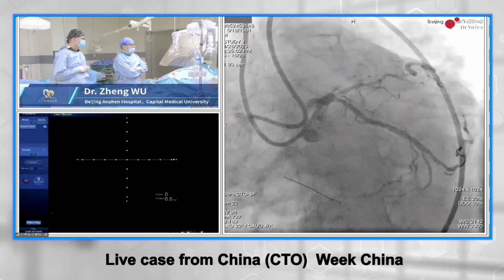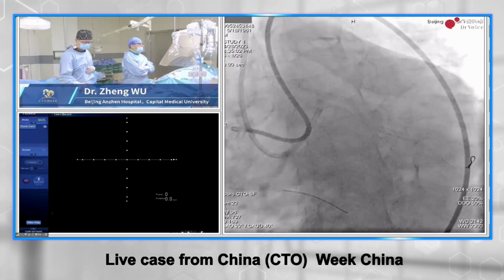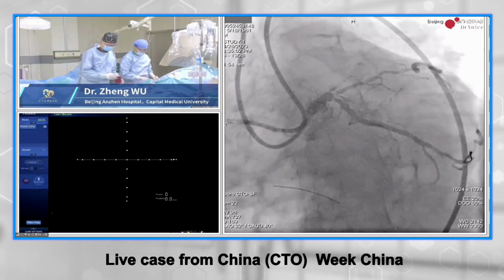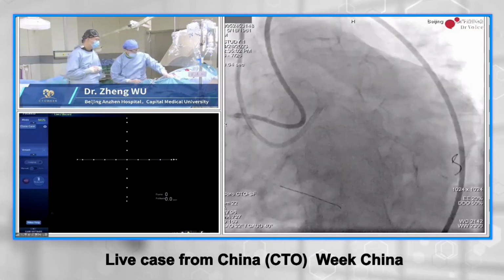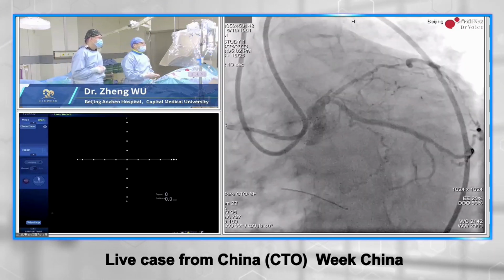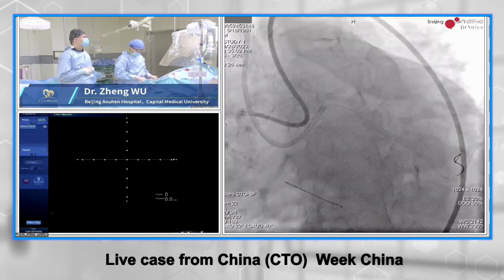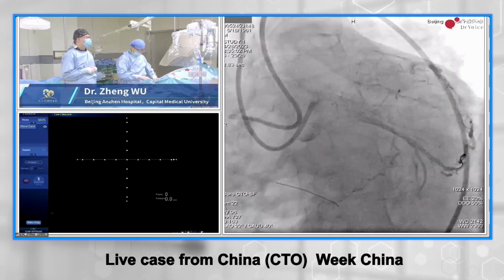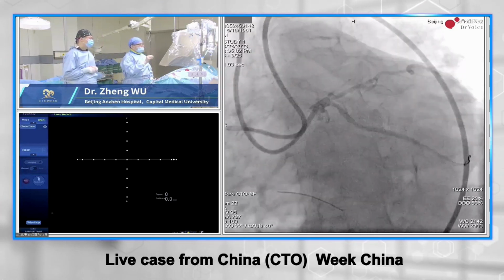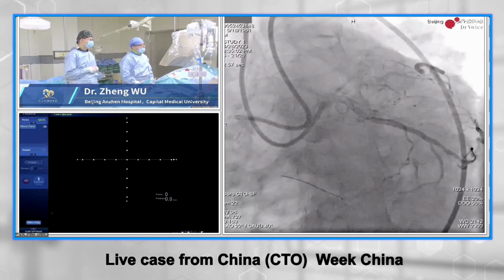Yes. Anyway, Professor Wang. My opinion, you should try the antegrade approach first. And we believe that your feeling will tell you which route is correct. Sure, of course. So what wire is appropriate for my first attempt? You can use the polymer jacket wire, XTA or XTR, to try it.